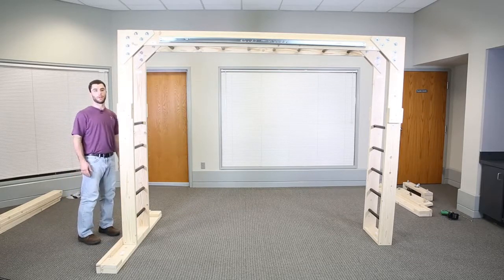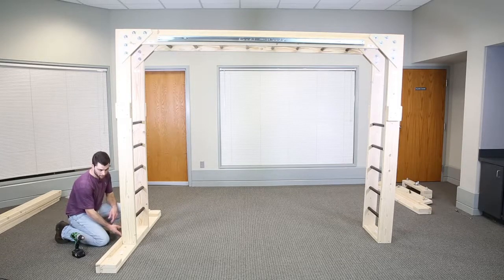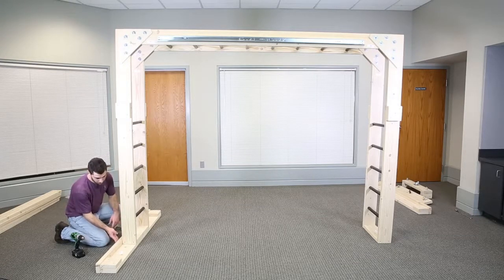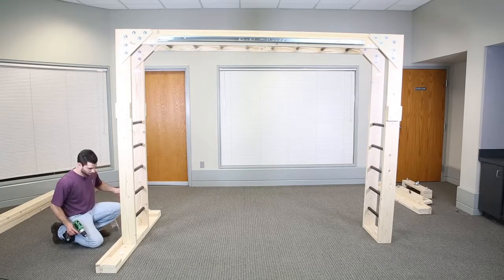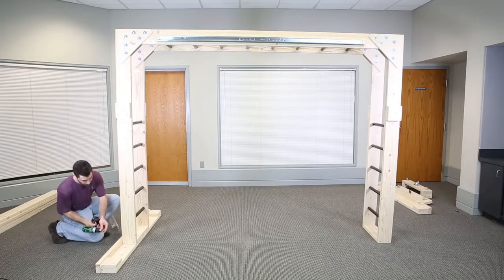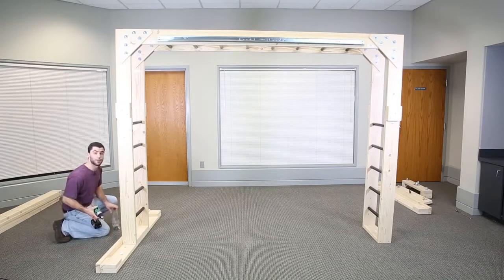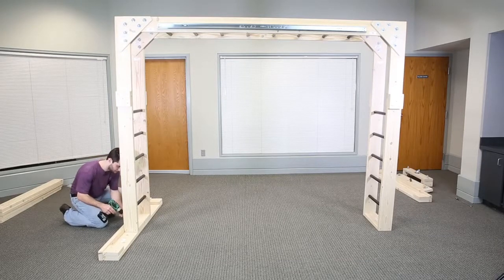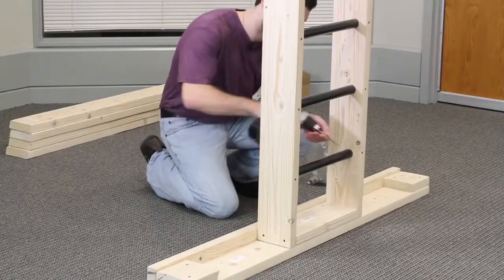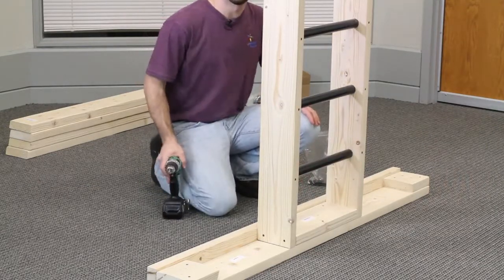For this step, you will now need your Phillips screwdriver or Phillips drive for your drill. If the base and the ladder are situated correctly, you'll notice that there are pre-drilled holes in the back of the base and in the bottom of the ladder that will line up with each other. Once you're lined up, take your 2.5-inch screws and your Phillips screw gun and drive the screws home in each of the pre-drilled holes. You will not need to make any holes yourself. Once the base is secure, move to the other side.